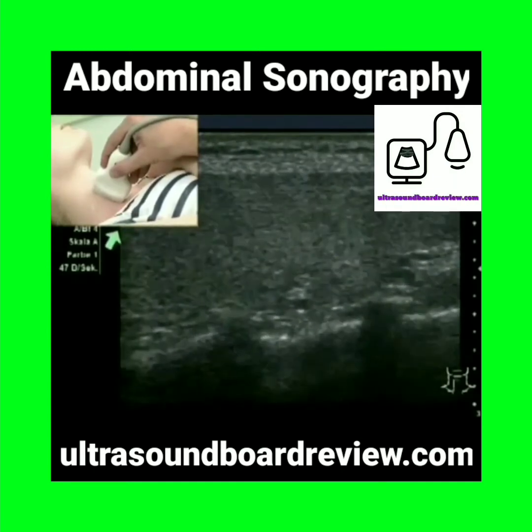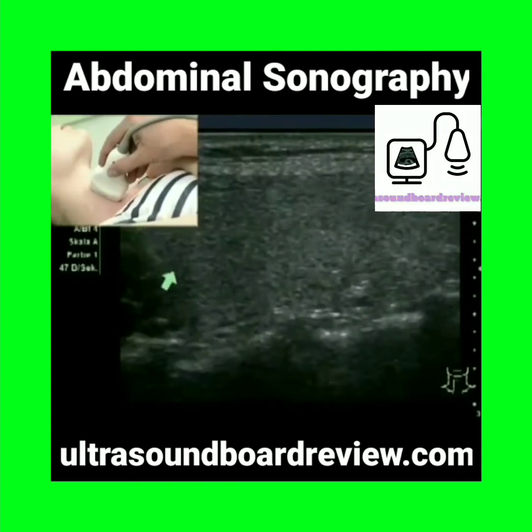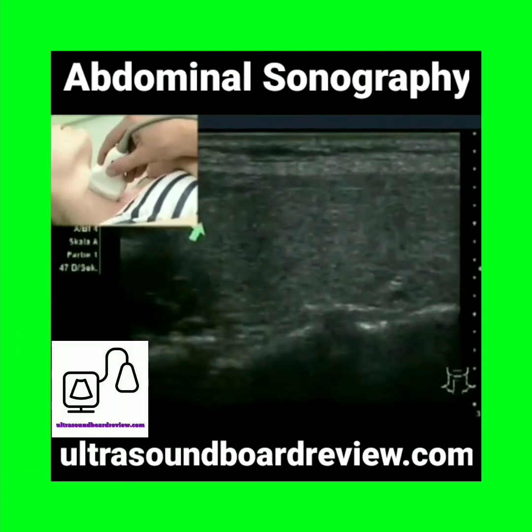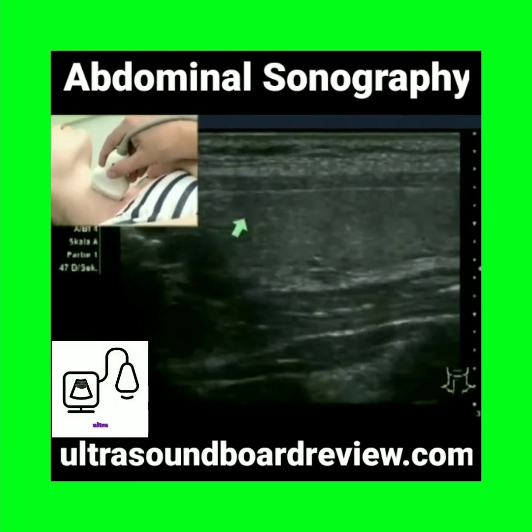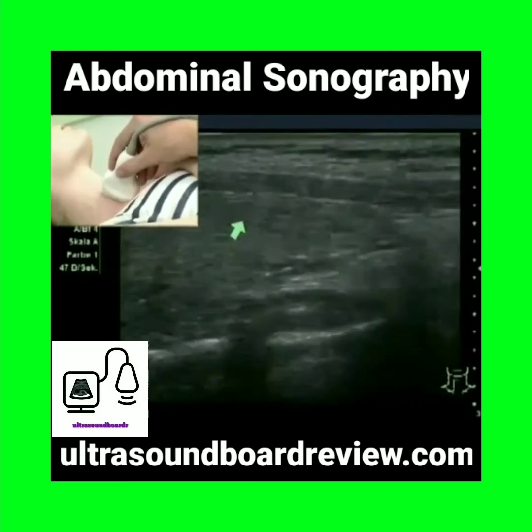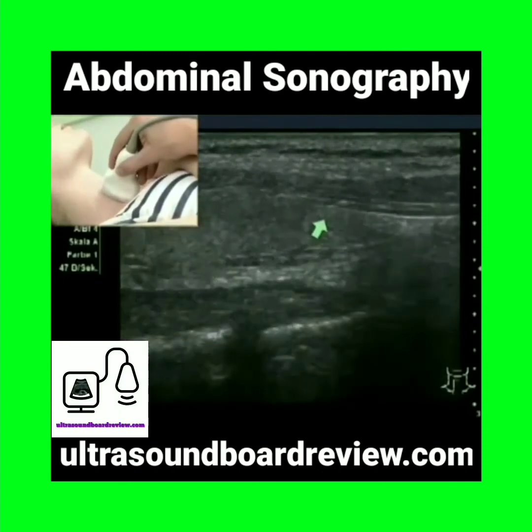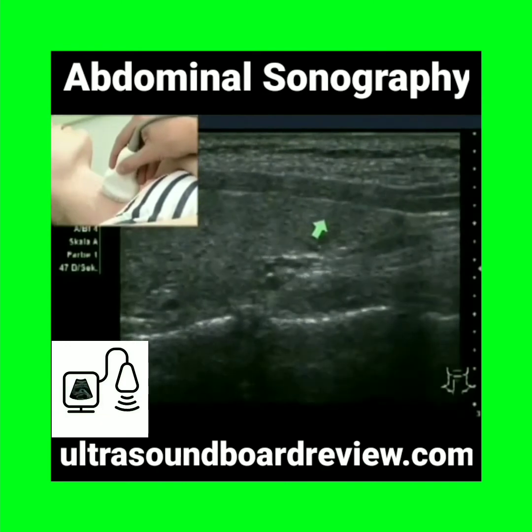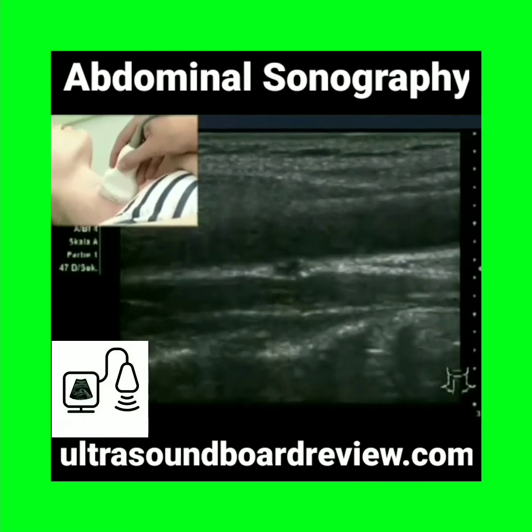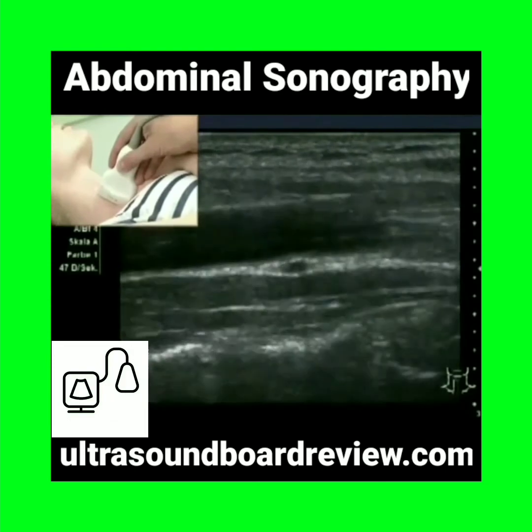And whenever the extension of the gland exceeds the size of the transducer, we decide to scan the upper part first, move or shift the transducer inferiorly, and scan the inferior part in a second step to assure that every single area of the thyroid gland has been visualized in two sections.